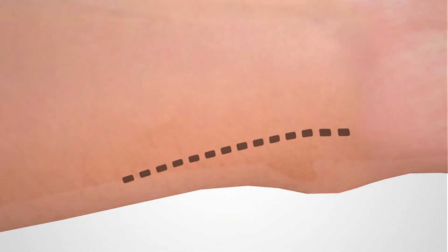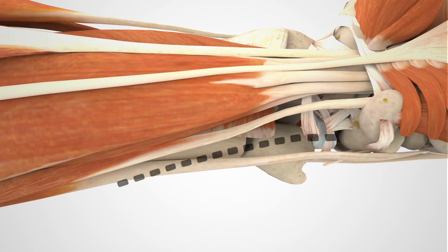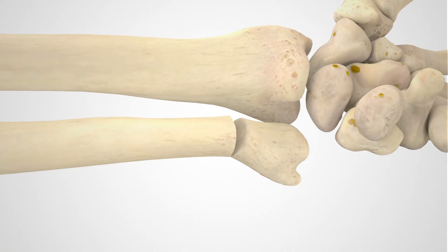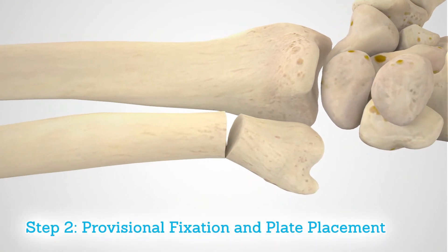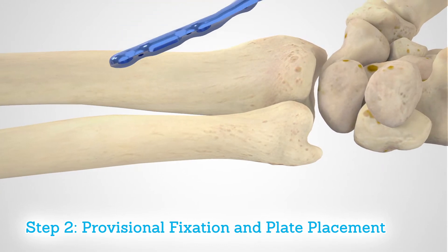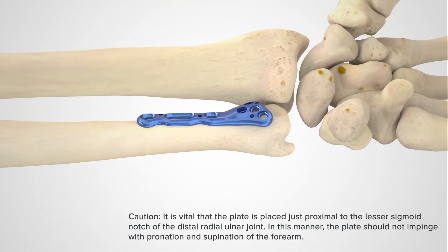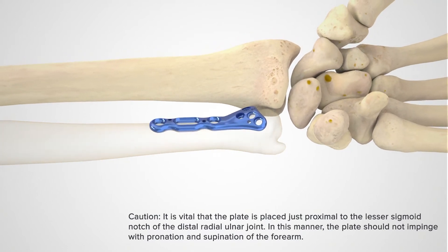Expose the fracture site using a longitudinal incision, taking care to appropriately identify and protect nerve and tendon structures. Place the VDU plate on the volar surface of the distal ulna, proximal to the sigmoid notch.